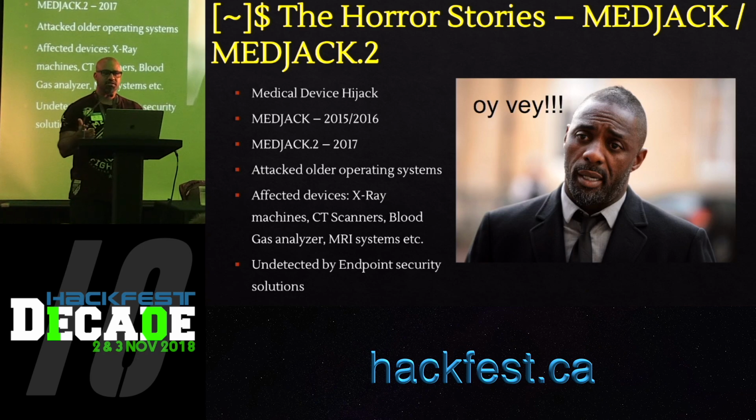Because the newer operating systems are protected against older vulnerabilities like MS08-067, so they would simply discard the malicious packet, and the packet wouldn't even reach the endpoint security solution. And the older operating systems running on these medical devices did not have an endpoint solution on the devices. So it was able to compromise tons of medical devices and then use them to pivot and compromise further systems. I think it used Citadel-infused malware for horizontal movement and compromised other systems on the hospital network.